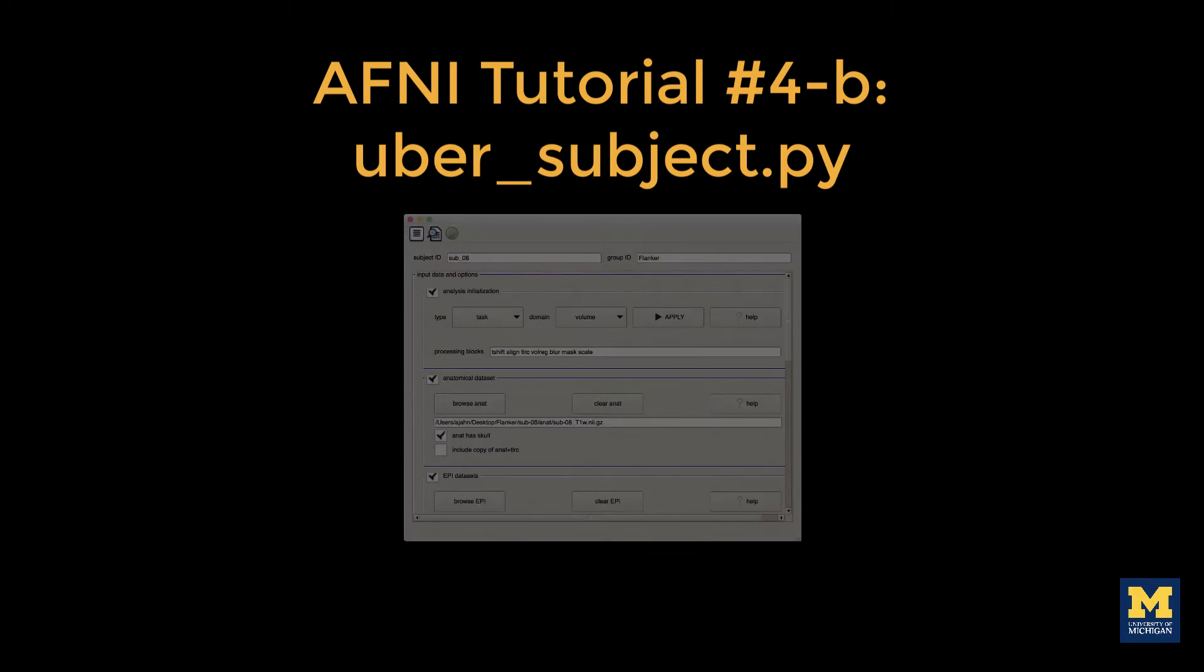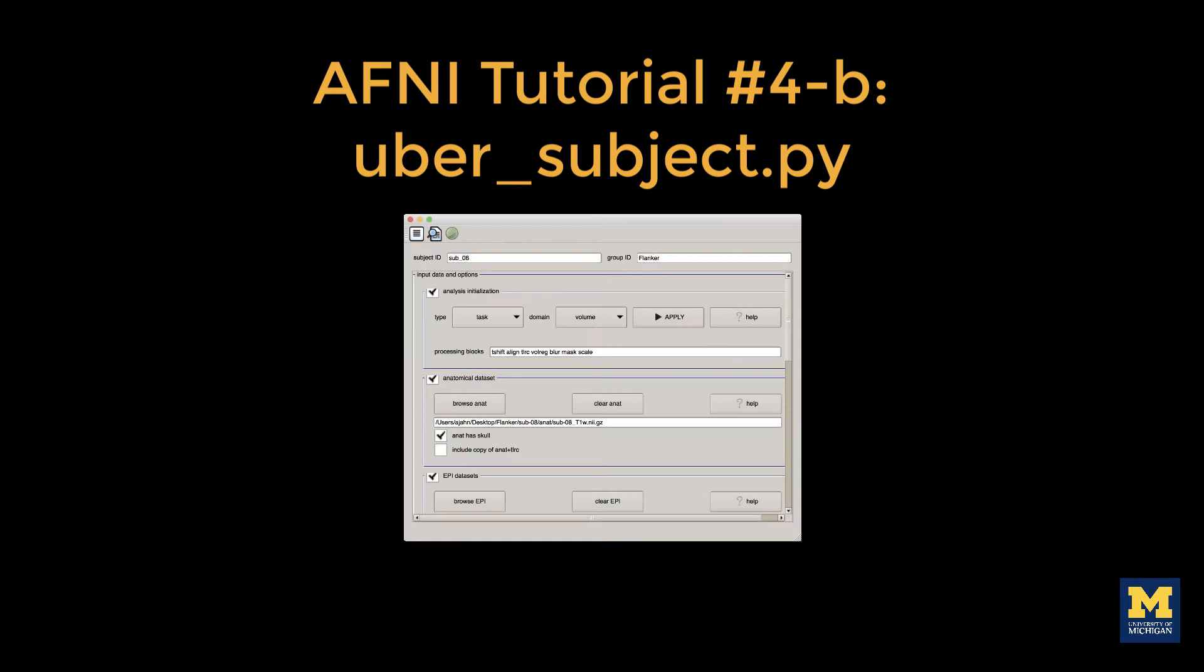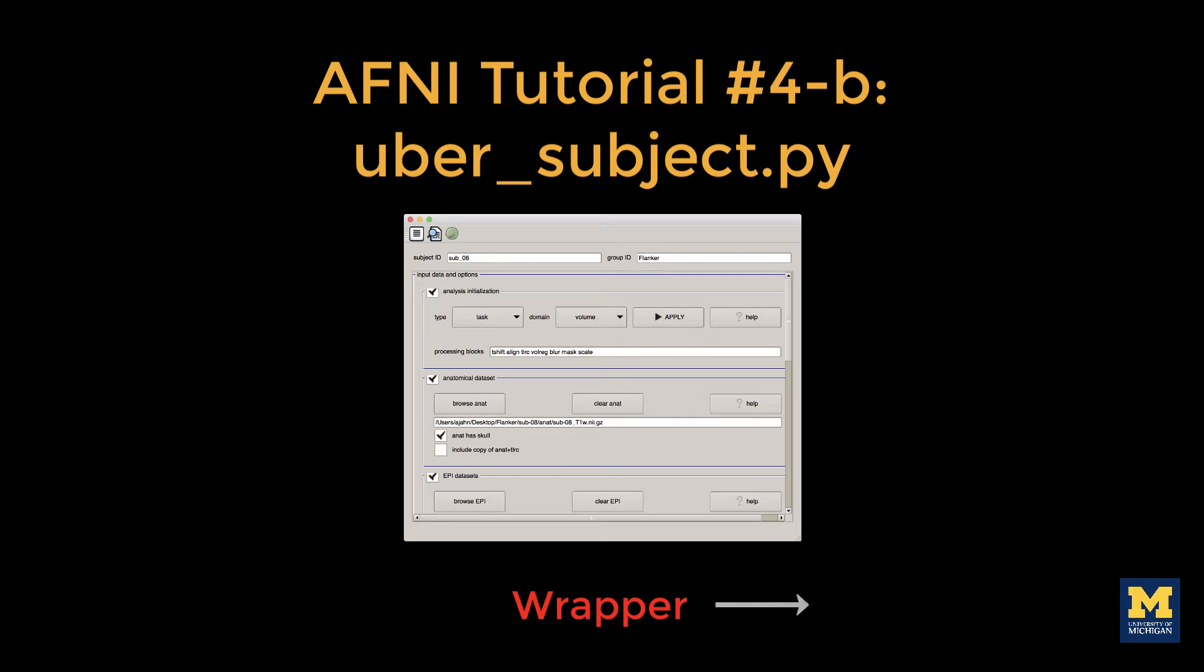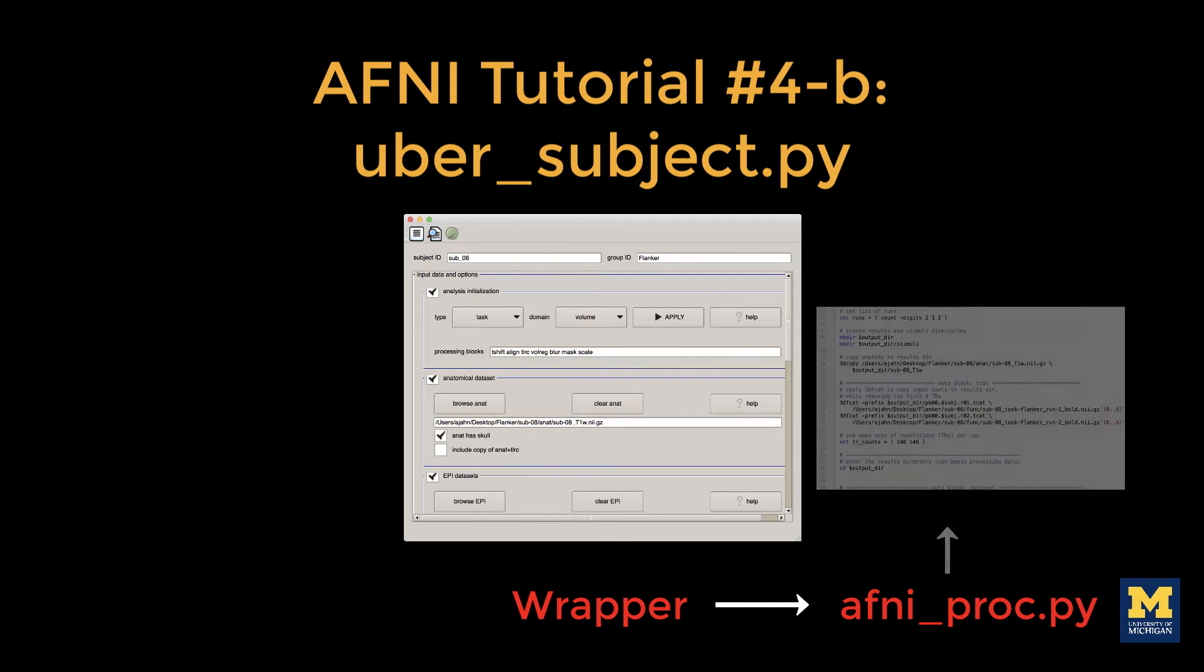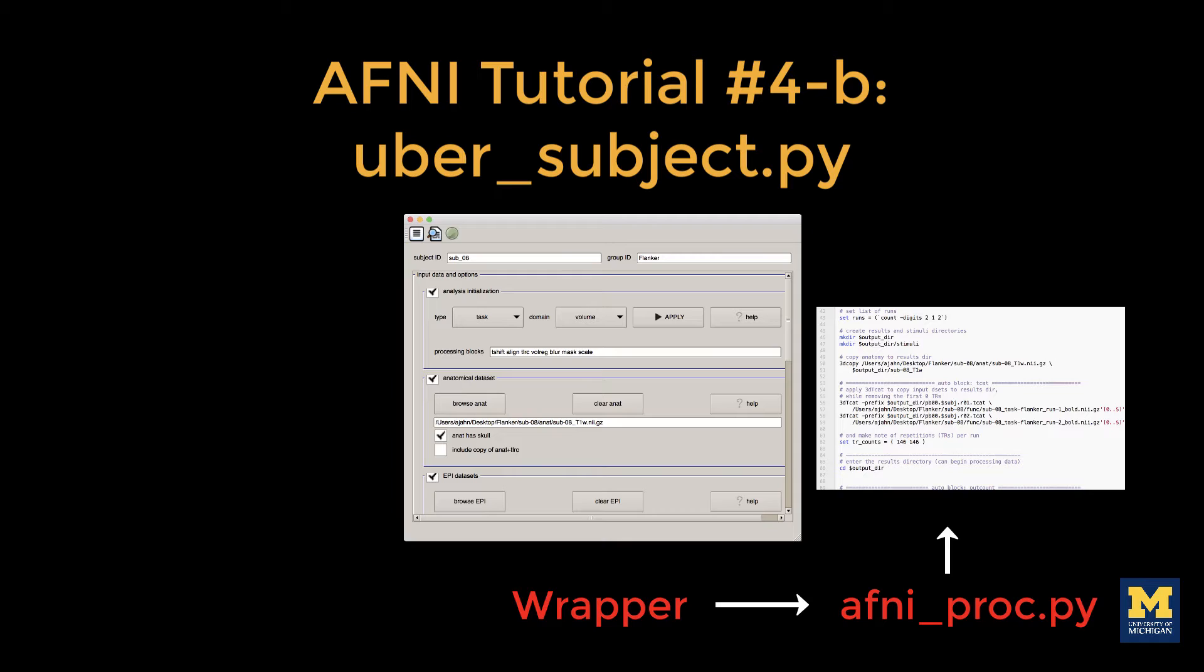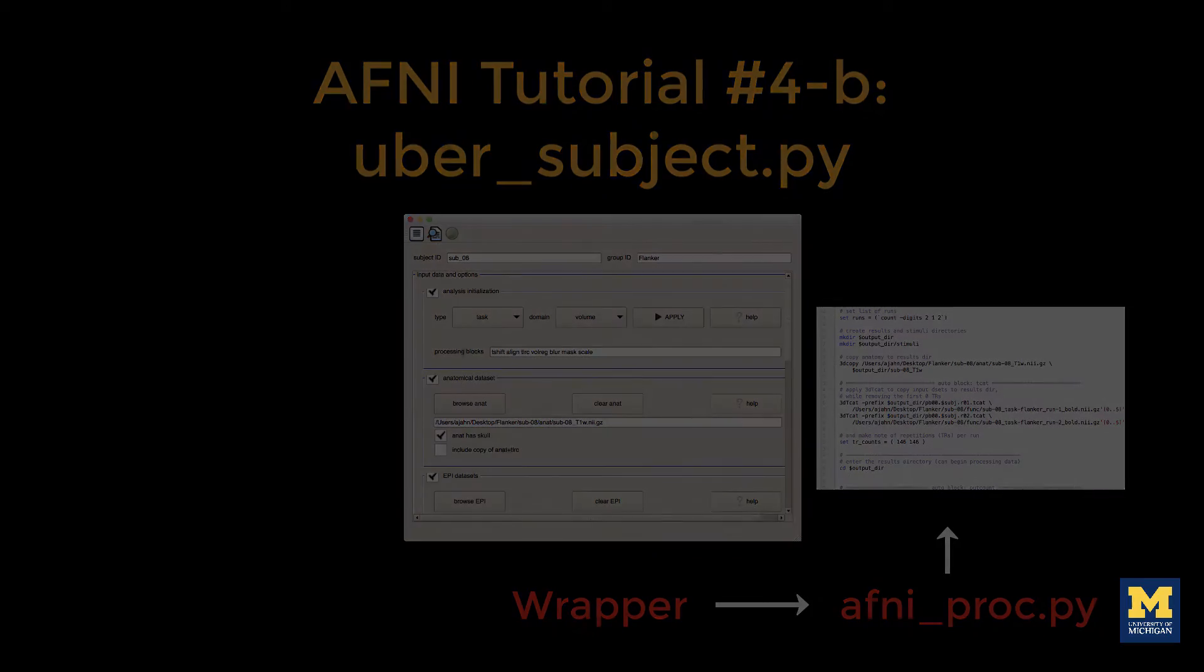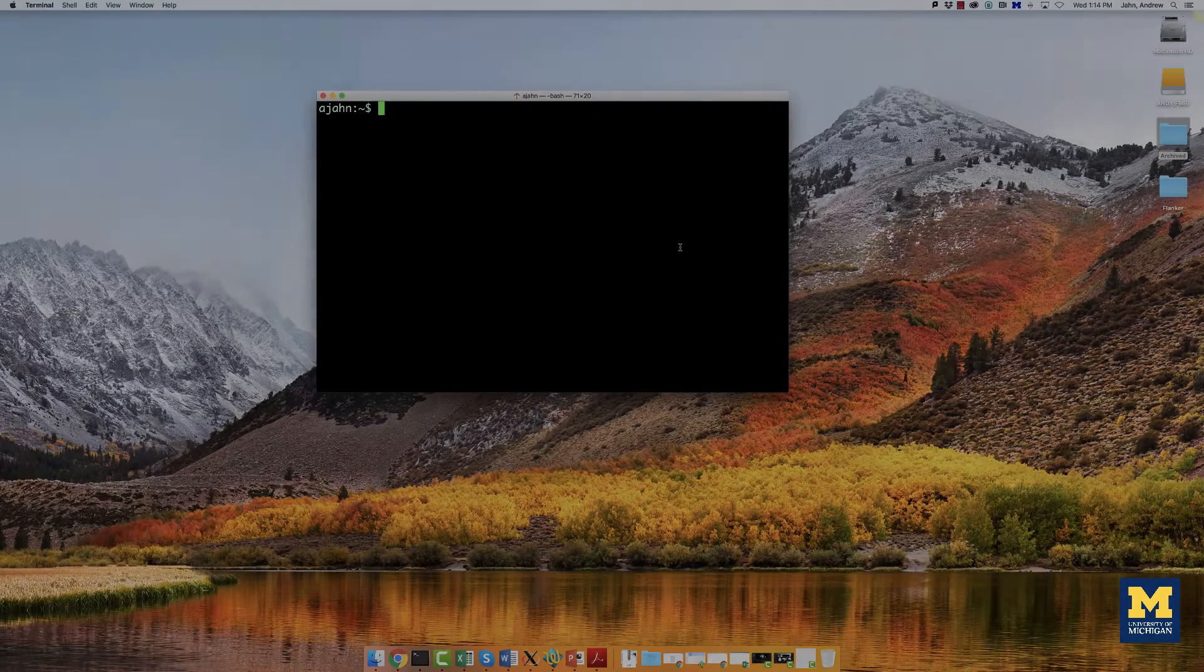afneseubersubject.py. Technically, Ubersubject is a graphical user interface that serves as a wrapper. That is, it takes all of the GUI inputs specified by the user and directs it into another wrapper called afneproc.py. This command then generates a large script that contains each of the individual AFNI commands needed to run each step of the preprocessing.